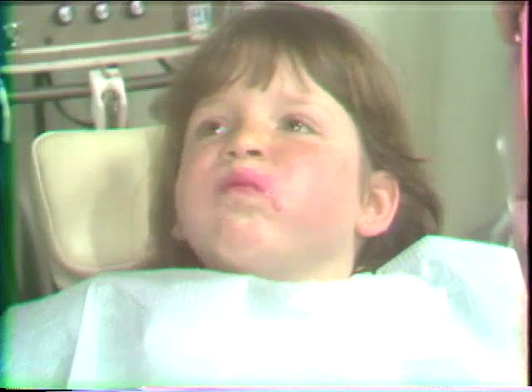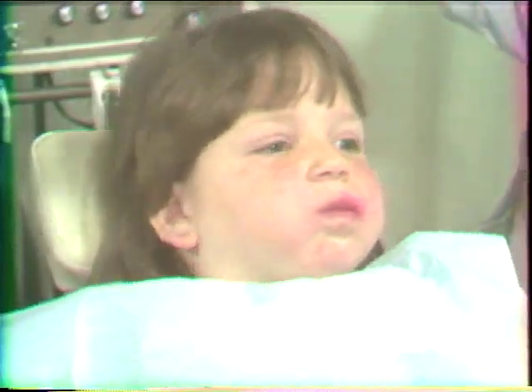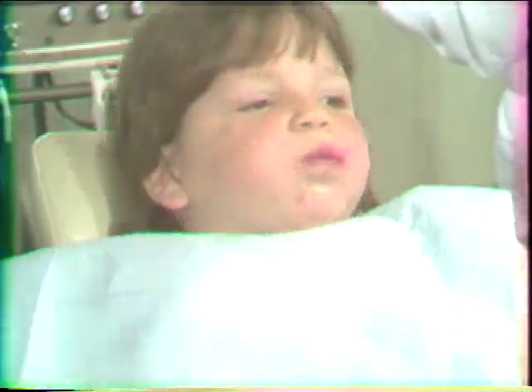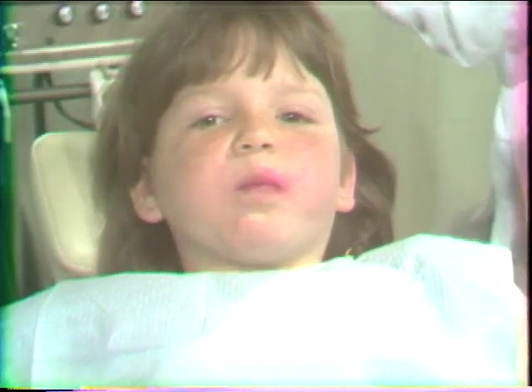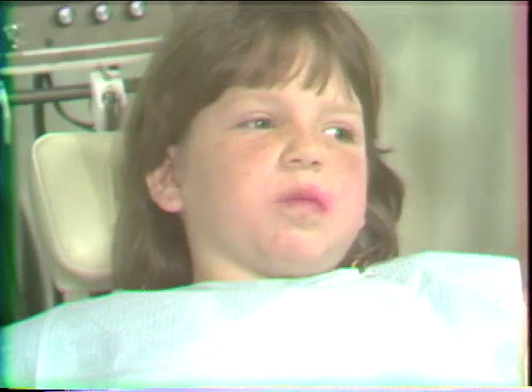This is followed by a 1 minute rinse with the remaining stannous fluoride solution. The patient should not rinse or eat for 30 minutes after the treatment. Routine dental procedures may be performed immediately.